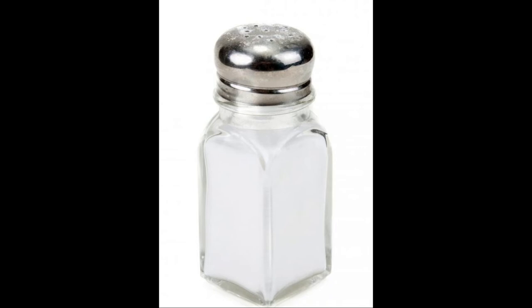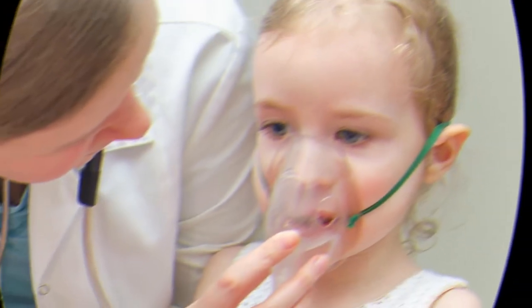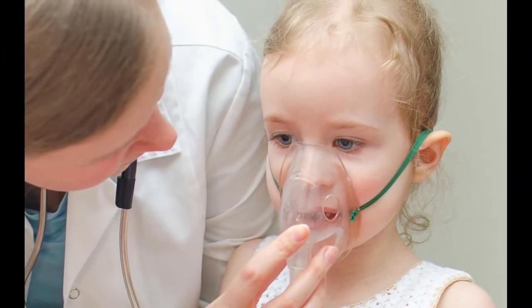Prepare the solution. Once you've identified the specifics of your device, it's time to get the saline ready. Saline solution can be purchased in many pharmacies and health food stores, but many people prefer to make their own. It is easy to do by mixing 1 teaspoon, about 5 ml, of ordinary table salt or sea salt with 1 quart, about 1 liter, of distilled water. Regular tap water is often a fine substitute if distilled water is not available, though this depends to a certain extent on its cleanliness.